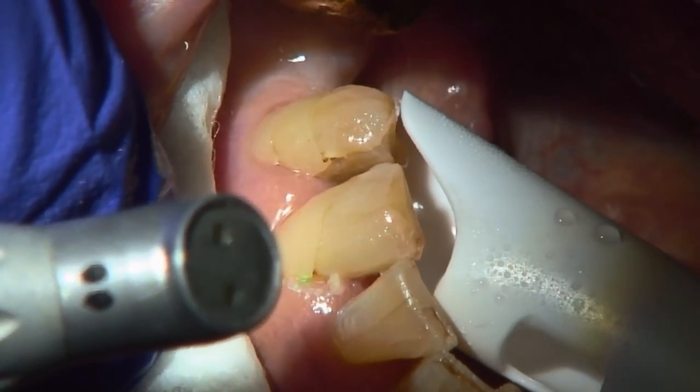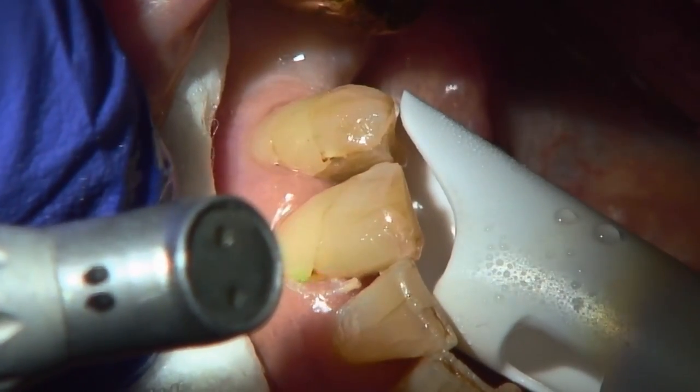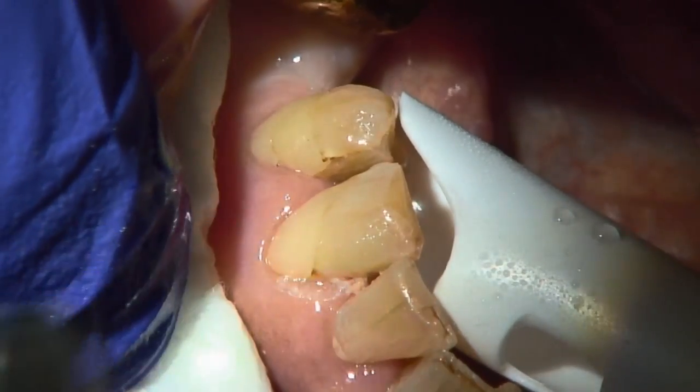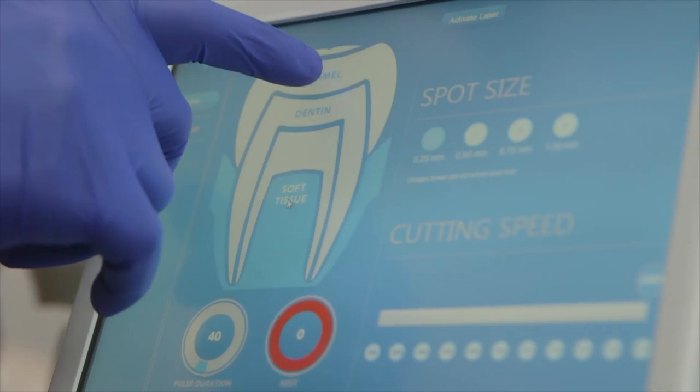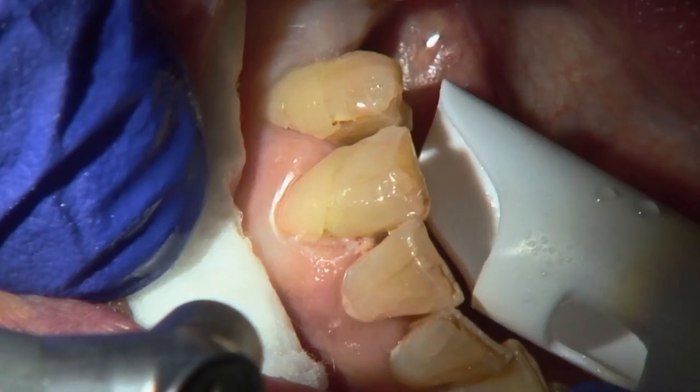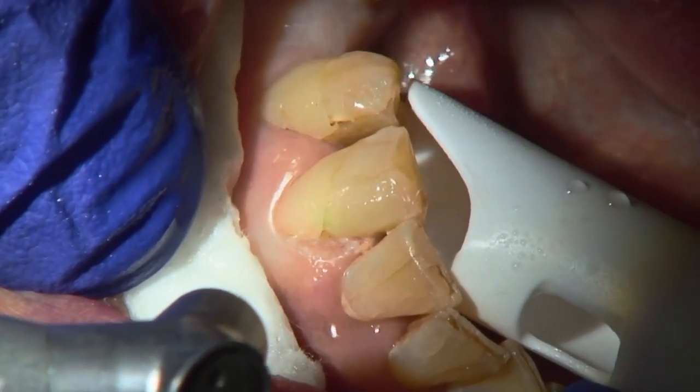That's the bottom line. I was able to ablate the soft tissue with Solea without anesthetic, without bleeding, switch the setting to enamel, prepare the enamel, excavate the dentin, ready to restore the tooth.